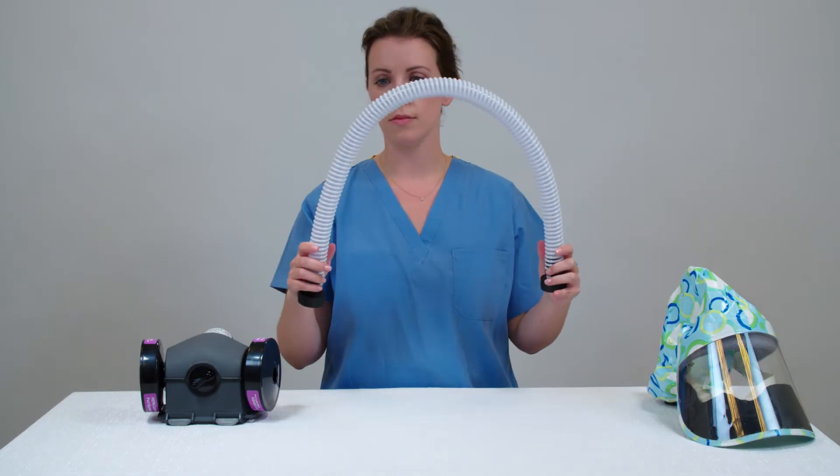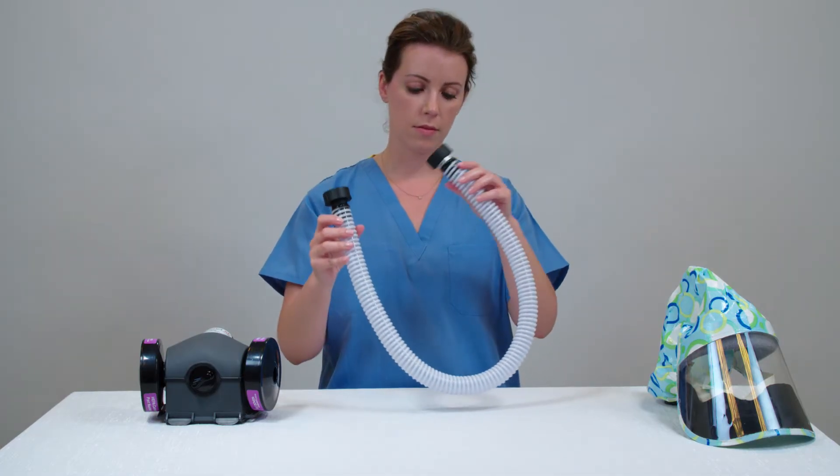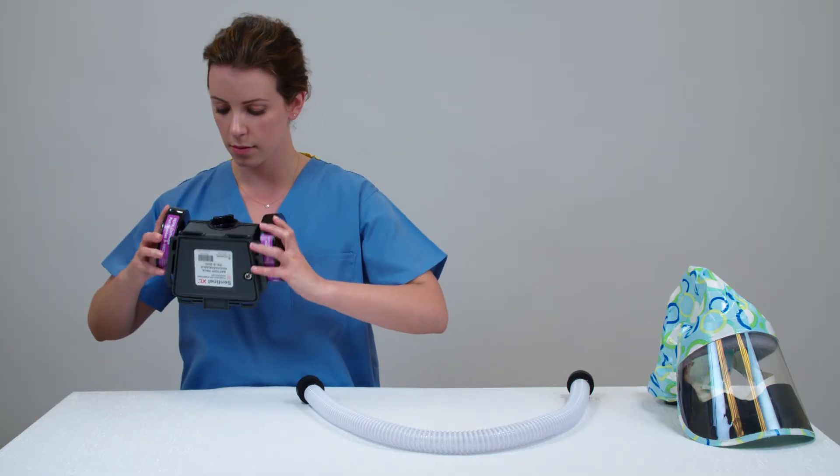Next, examine the breathing tube — look for any cracks or tears. Finally, inspect the blower unit.